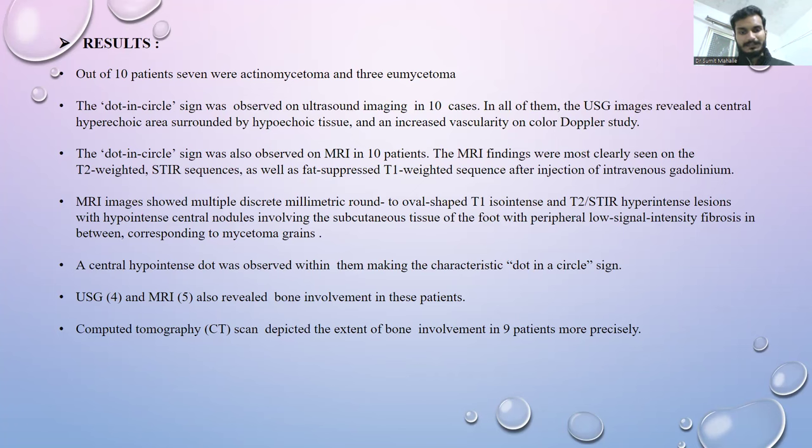CT depicted the extent of the bone involvement in 9 patients more precisely.